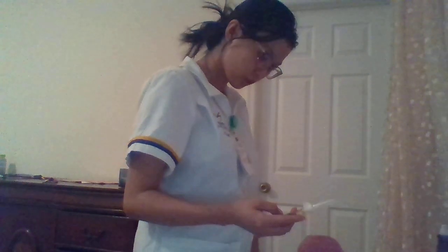So this is the right patient, Anapawasky, and the medication is vitamin B12, the orange says vitamin B12, it's 0.5 ml as well as 500 mcg, and this is correct as well, and the date and time is correct, and the route is subcutaneous, and this is the subcute. And after that, I am gonna document.